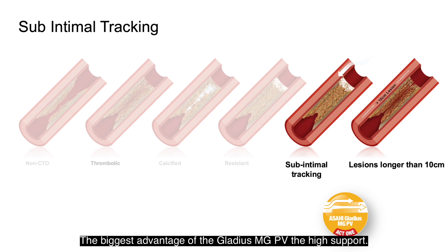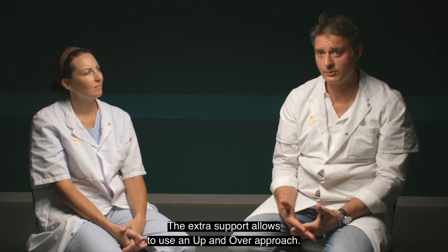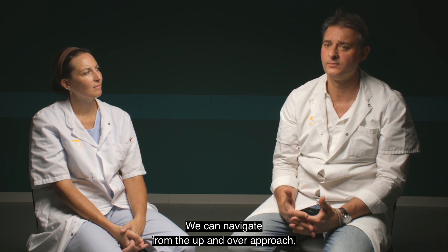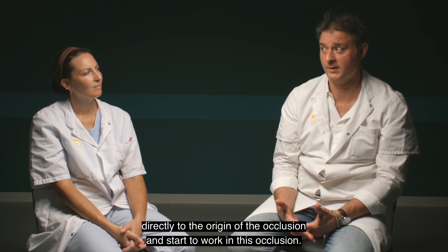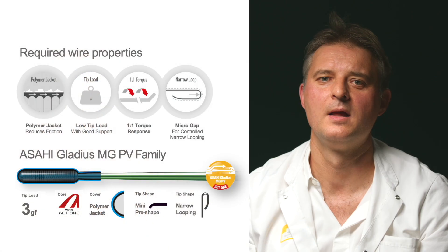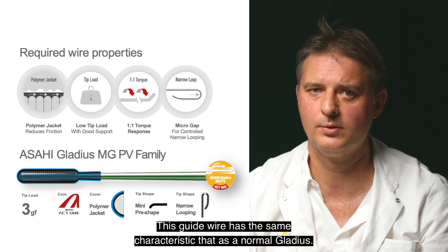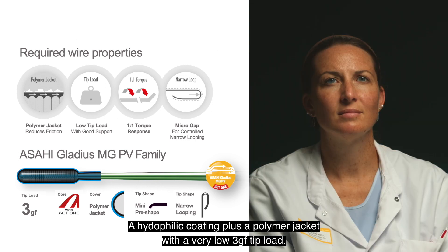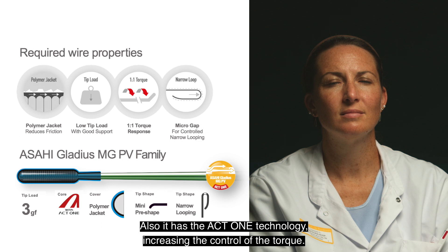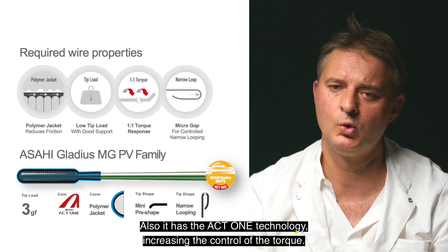The biggest advantages of the Gladius MGPV: it has extra support, allowing an up-and-over approach. We can navigate from the up-and-over approach directly to the origin of the occlusion and start to work in it. This guide wire has the same characteristics as the normal Gladius — a hydrophilic coating plus a polymer jacket with a very low tip load of 3 grams — and also the ACT1 technology increasing torque control.